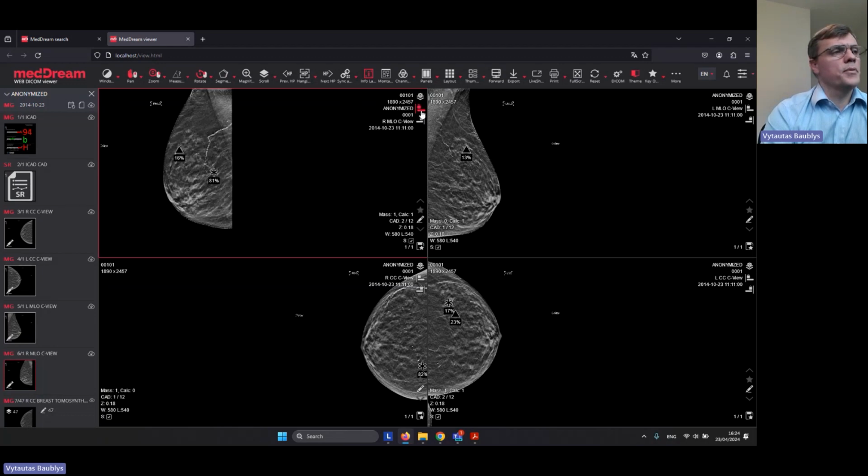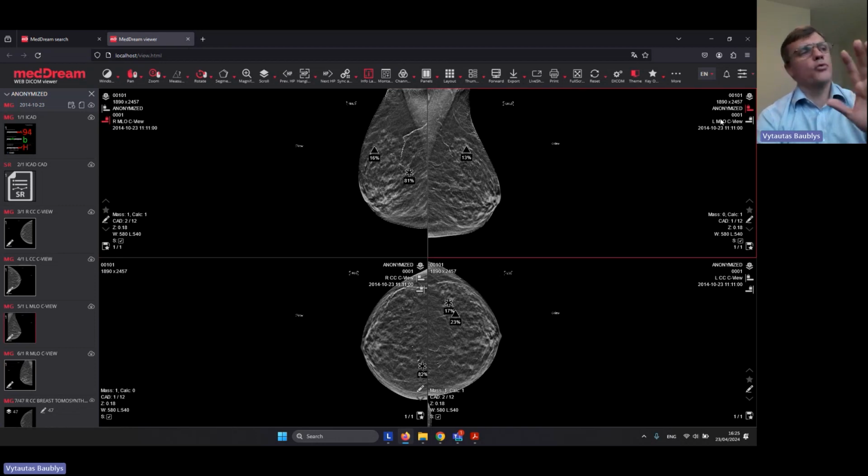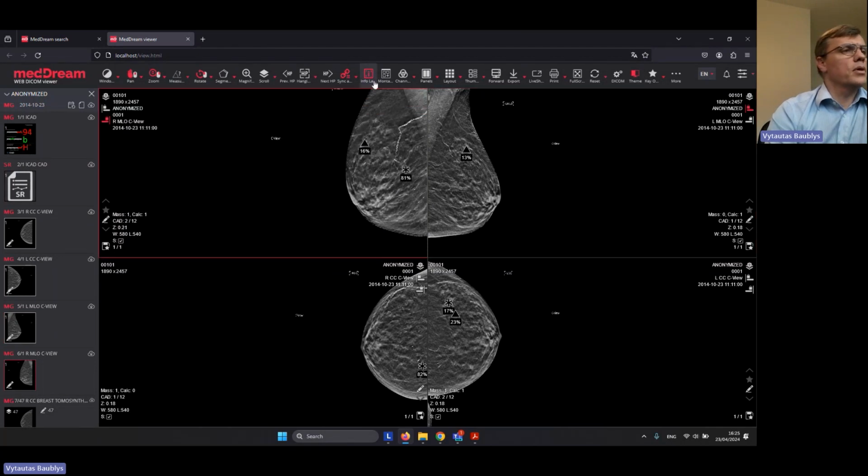If I click alignment, as you see, it moves all the demographic data to the left. Now I would like to move from this image, so I can again select what I am aligning to this border, and automatically my data is moved into the right position. In the bottom, I will not change anything, just to show how the zooming works. So now I can select the zooming. I select propagate to all zoom synchronization. So now when I zoom, yes.